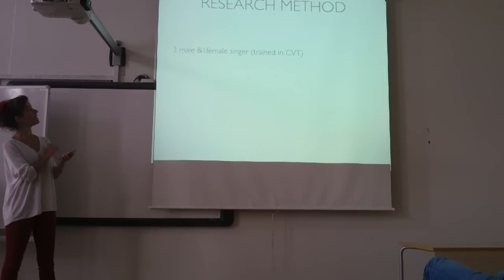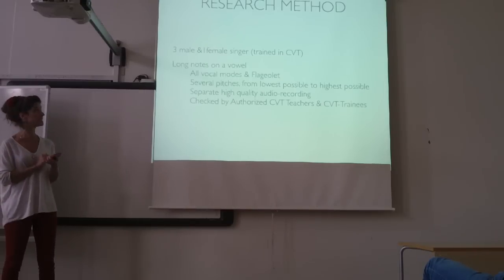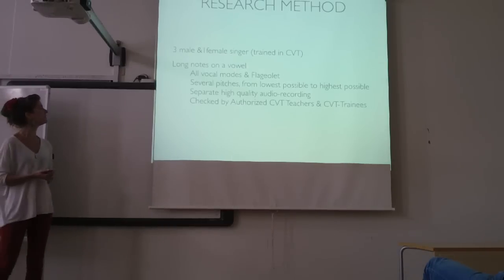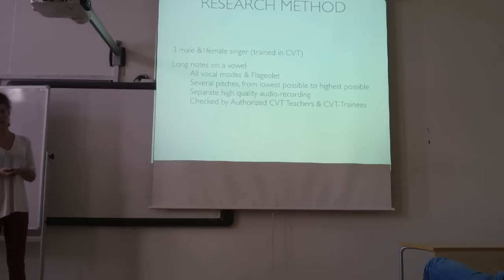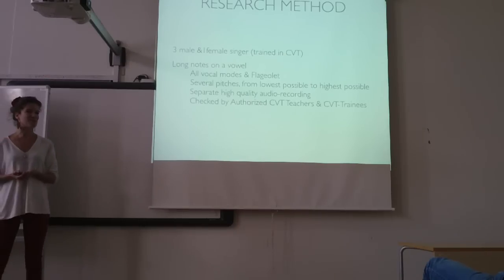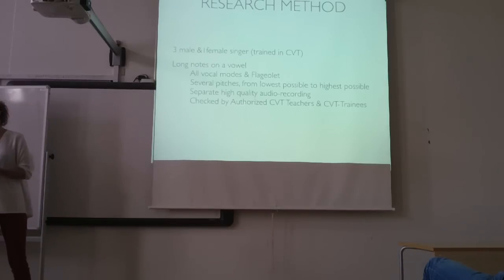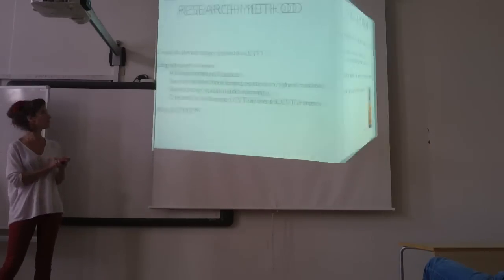These were our methods. We worked with 3 male and 1 female singer, and they were all trained in CVT. They produced a long note on a vowel, well, several long notes on a vowel, in several pitches, from the lowest possible to the highest possible. We also made a separate high-quality audio recording because some of the very loud sounds, the microphone of the VKG camera couldn't handle them. This recording has been checked by several authorized CVT teachers and CVT trainees, and we have used the videokymography of Kymo.